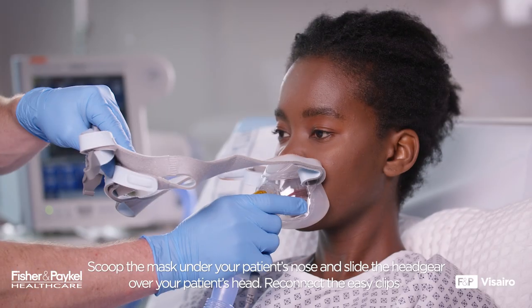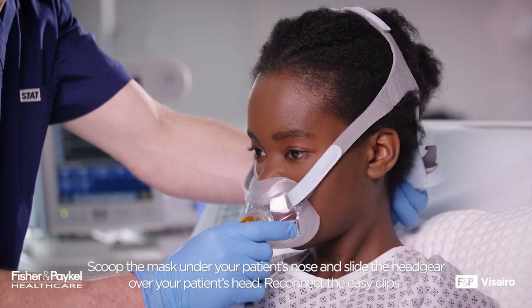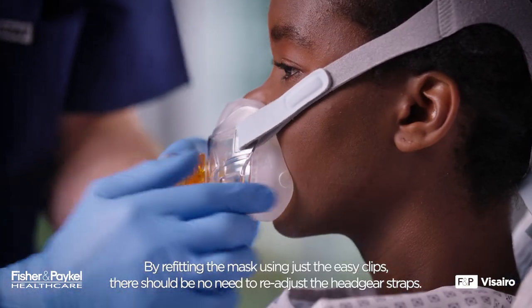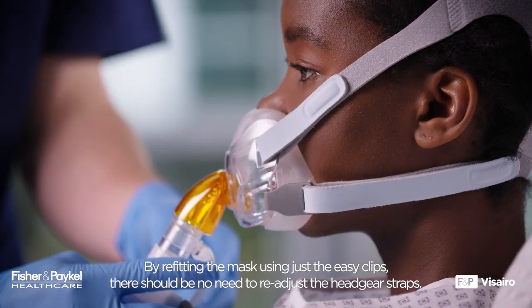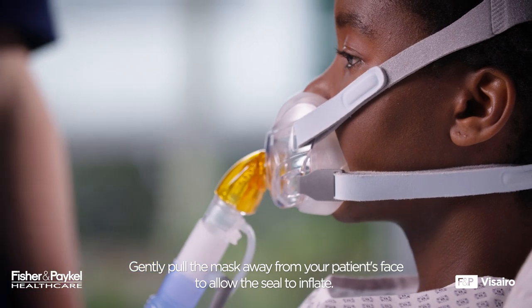Refitting the Mask. Scoop the mask under your patient's nose and slide the headgear over your patient's head. Reconnect the easy clips. By refitting the mask using just the easy clips, there should be no need to readjust the headgear straps. Gently pull the mask away from your patient's face to allow the seal to inflate.